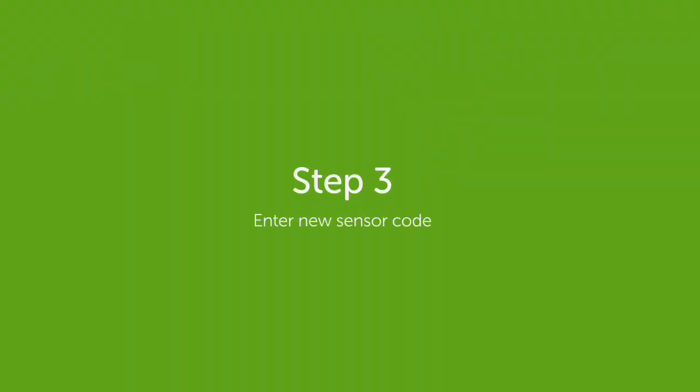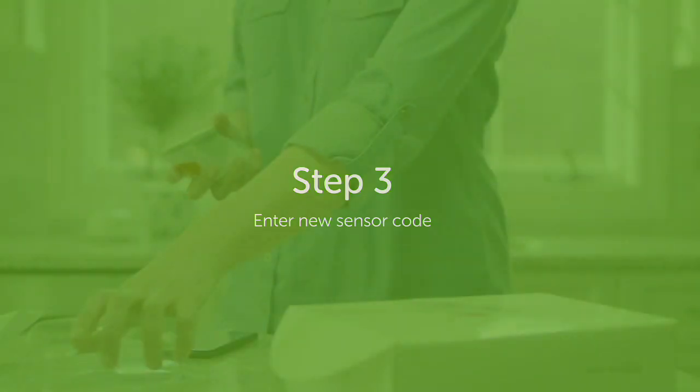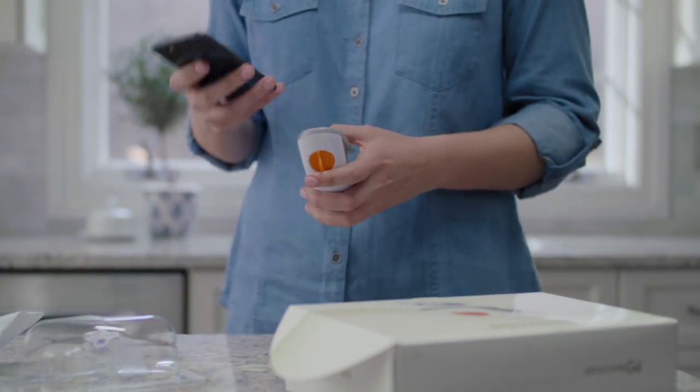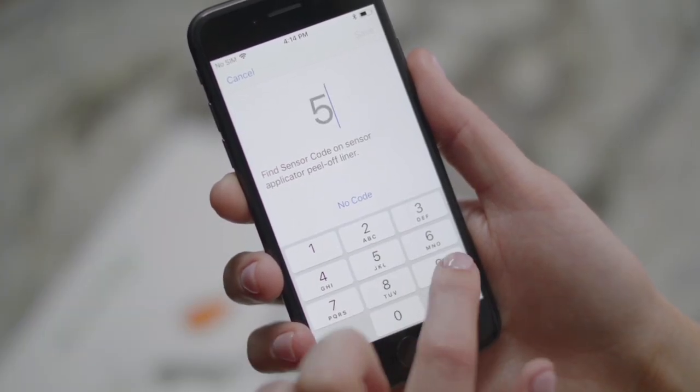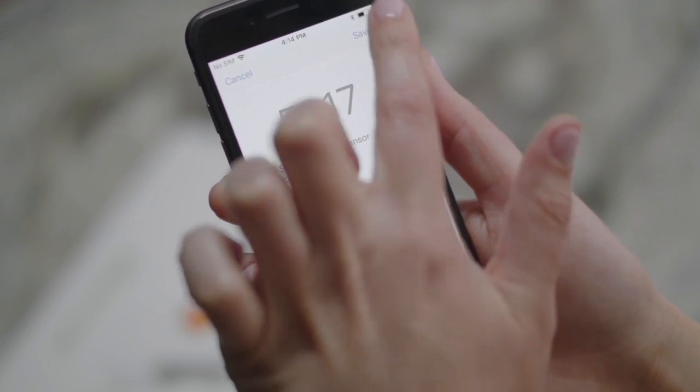Next, you will need to enter a new sensor code. Each code is specific to that sensor. Grab a new sensor and enter the code. You can either take a photo of the code or enter it manually. I will enter the code manually.